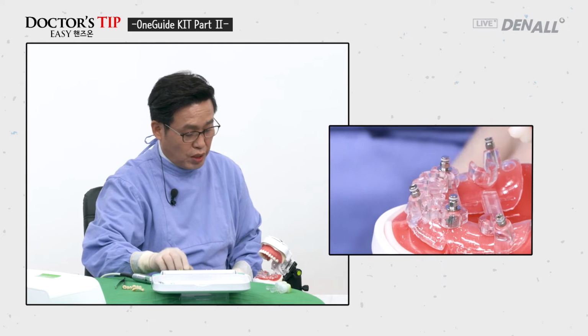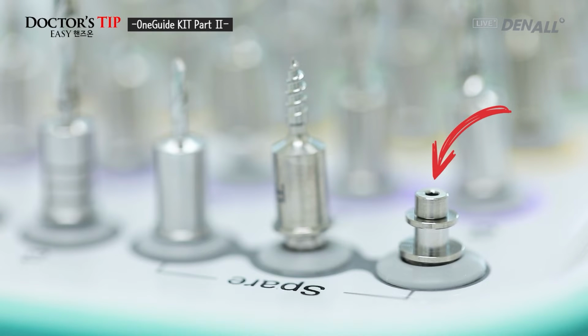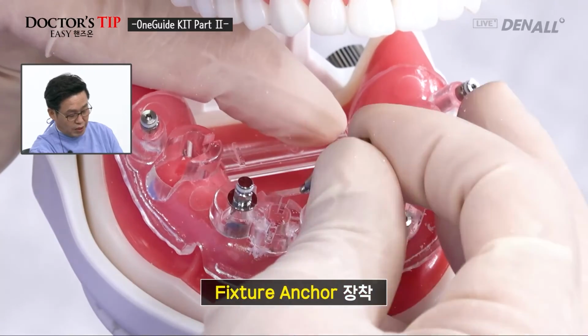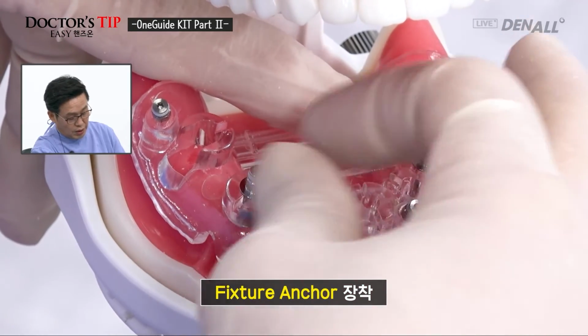Both canine sites implants have been placed, and as I mentioned earlier, because there's fixture anchor, I'm going to connect the fixture anchor on both canines. It's in. Yes, we can proceed, and it's already fixated, but I can show you.